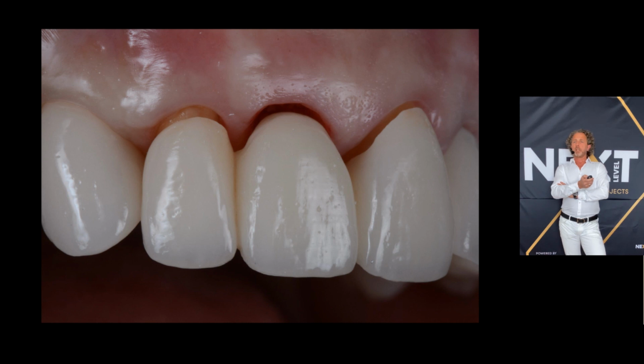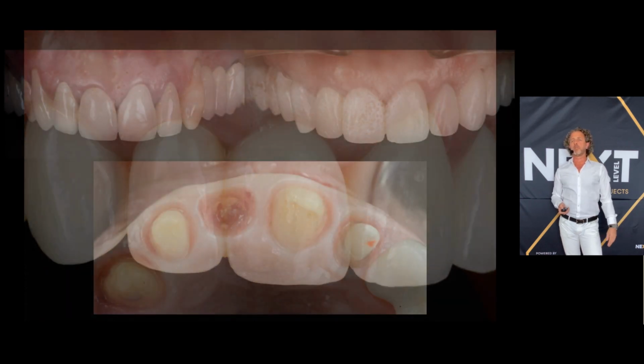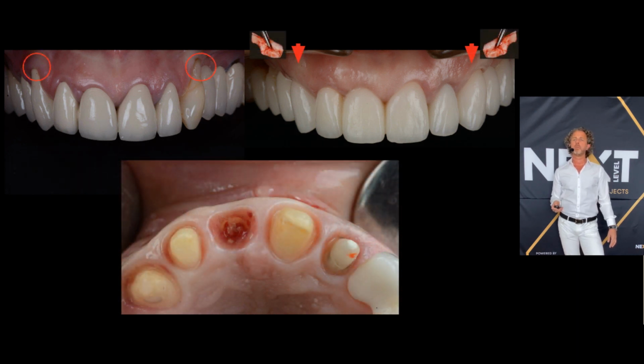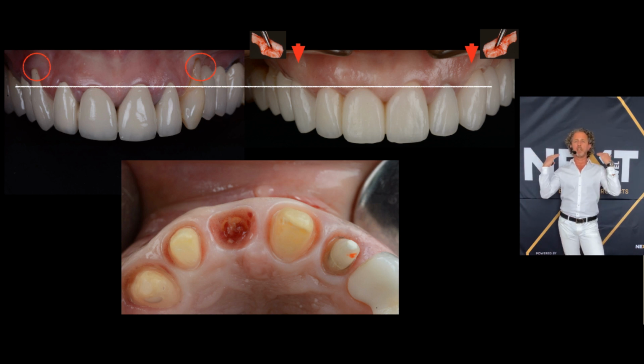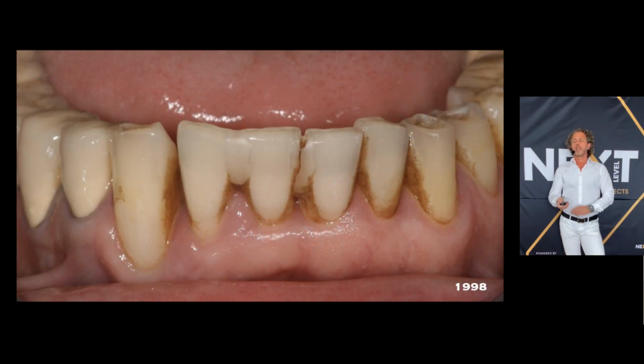The pontic bridge, and this is the final situation. From frontal, now you can see it didn't lose any tissue, we just gained by adding connective tissue graft and the canines. And the third variation, and this is the last one, is called the root submerge technique.